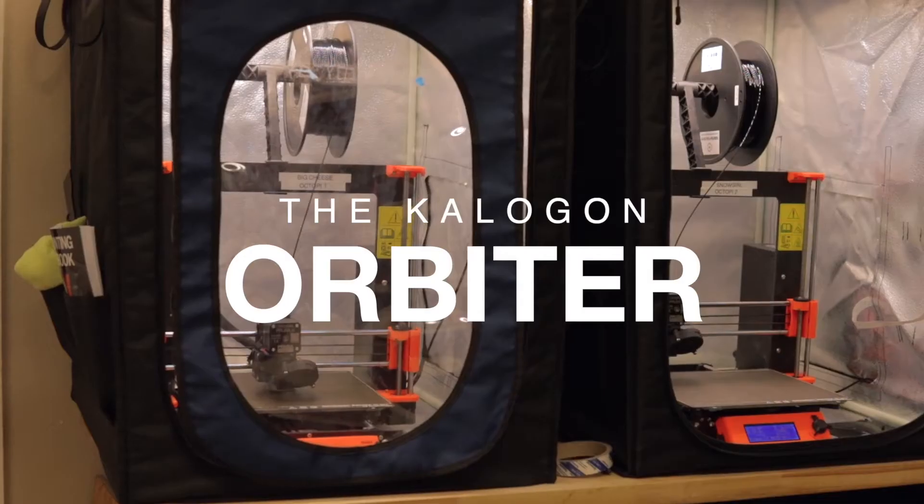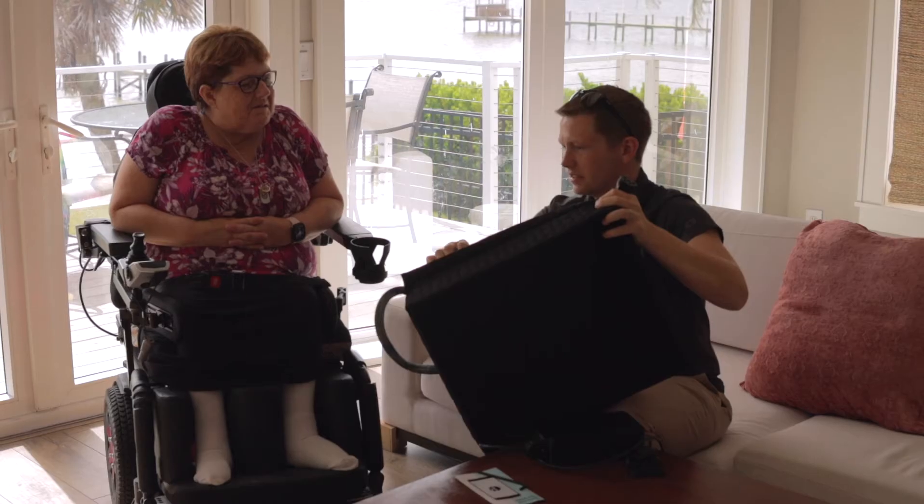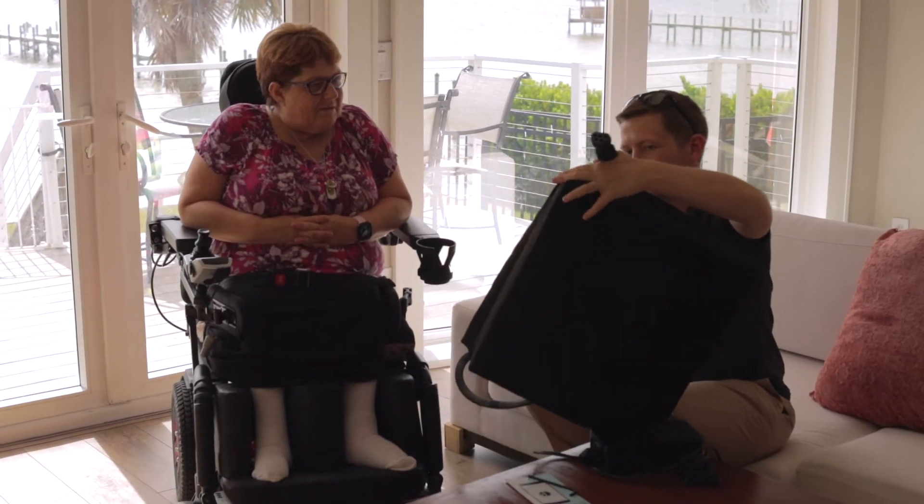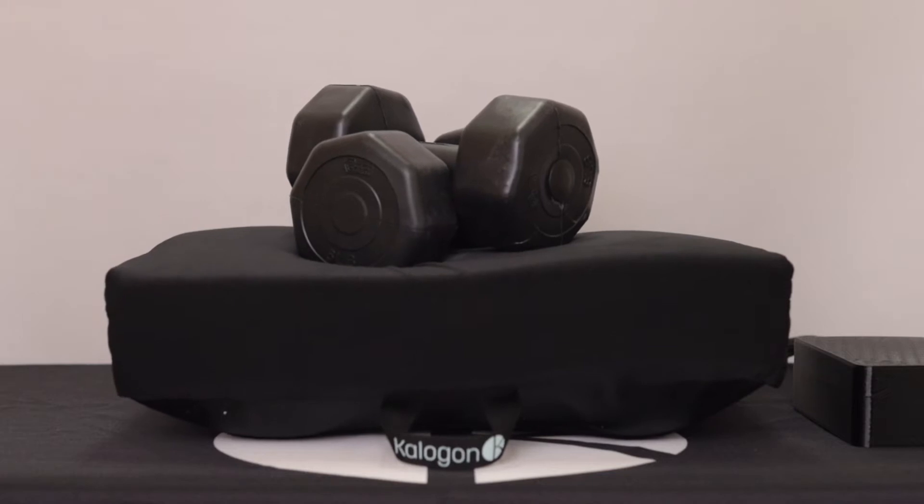The Caligon Orbiter has many features that are constantly being updated. The cushion itself is made up of a foam layer on top of an air bladder system. This system contours the foam to the user.